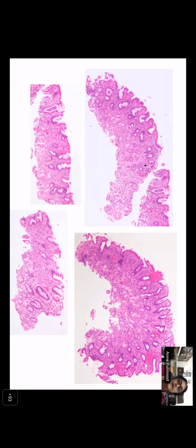So the first lesson to learn today is that in a mucosal biopsy, just having absence of the surface epithelium doesn't make it an ulcer. The biopsy process itself, sometimes the biopsy may be poorly oriented, or fragmented, or they may have pulled off the surface epithelium. To actually say that there's an ulcer, you have to see some inflammatory exudate, or necrotic material, or granulation tissue. Since we're not seeing any of those, this is not a true ulcer. So there is no ulcer seen in this biopsy.